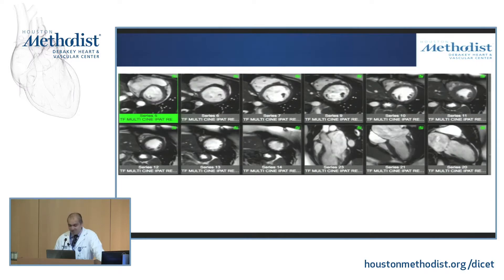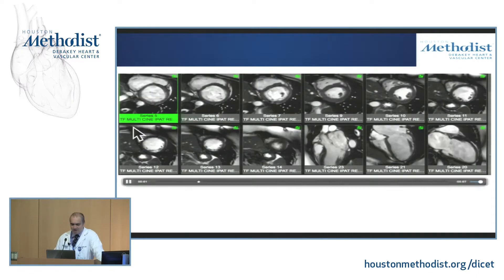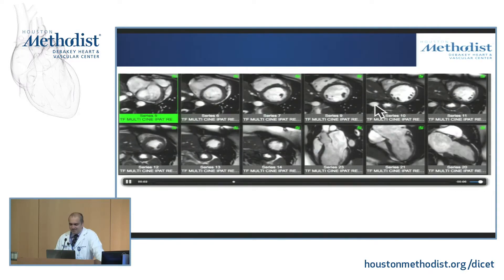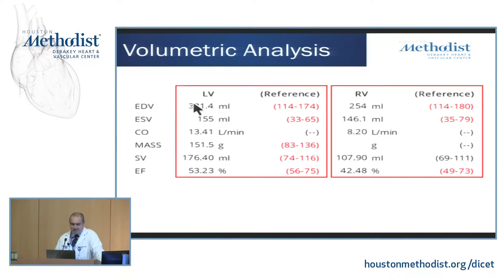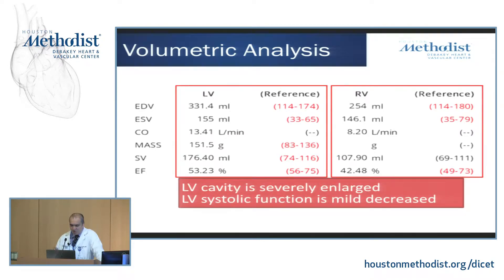Here are the images for this patient. This is typically a non-contrast examination that takes about 10 to 15 minutes to acquire. On the CMR, we can see the mitral regurgitation jet, the left ventricle certainly looks dilated, and the ejection fraction looks a little bit on the sluggish side. The numbers: LV end-diastolic volume was quite big at 331 mLs, with a stroke volume of 176 mLs, and an ejection fraction of 53% — by CMR, 56 or 57 is the lower limit of normal, so this would be considered mildly reduced. So we've got significant LV dilatation and mild LV dysfunction.